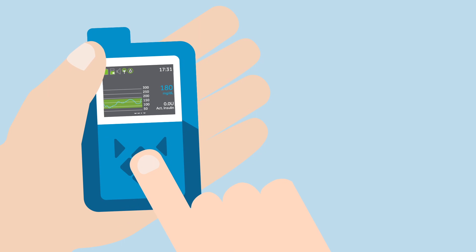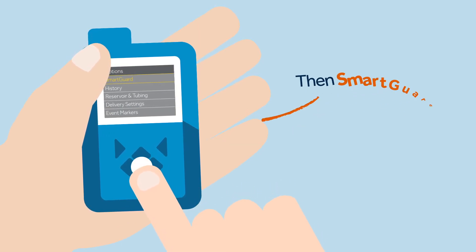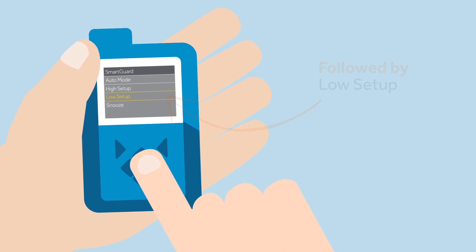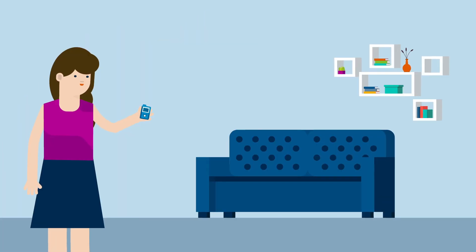To turn on the smart guard suspend before low feature, Sophie must press options, then smart guard, then low setup. Now Sophie can access the smart guard features menu and enter her required settings.